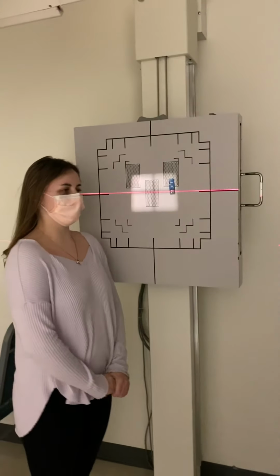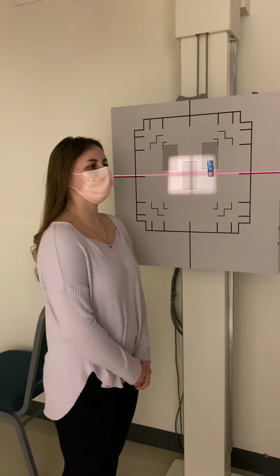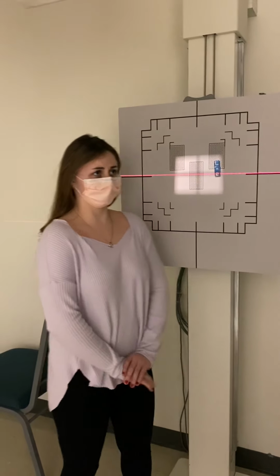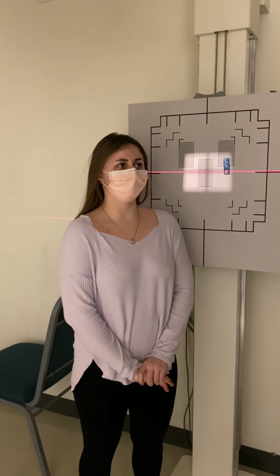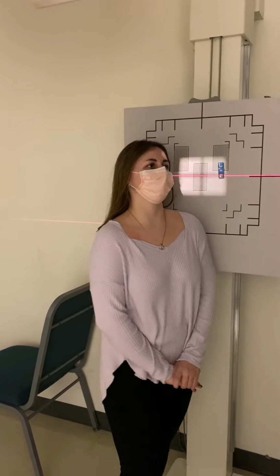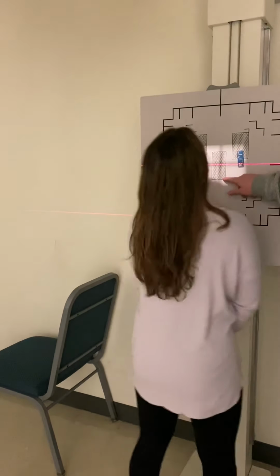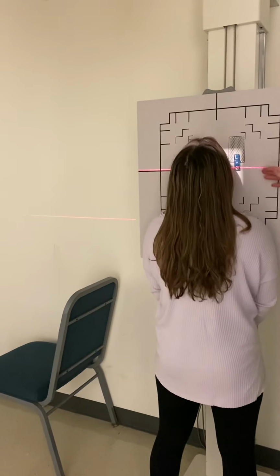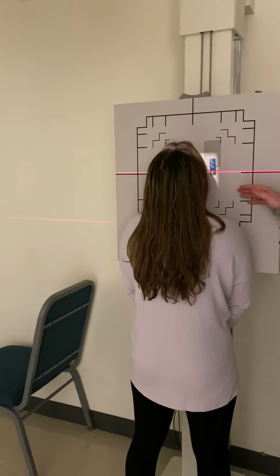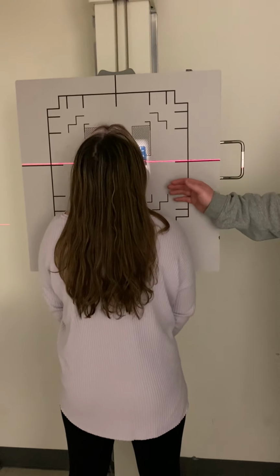And my last projection is the, let's see here, modified Waters. So we're going to have her rest the chin on the board. We're going to make sure her MSP is perpendicular, and we're going to adjust the neck so the OML forms an angle of 50 degrees with the plane of the IR.